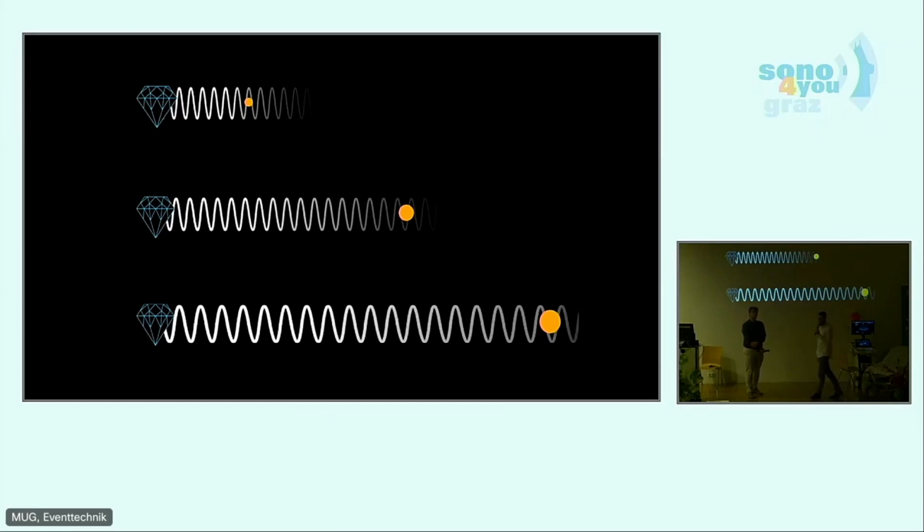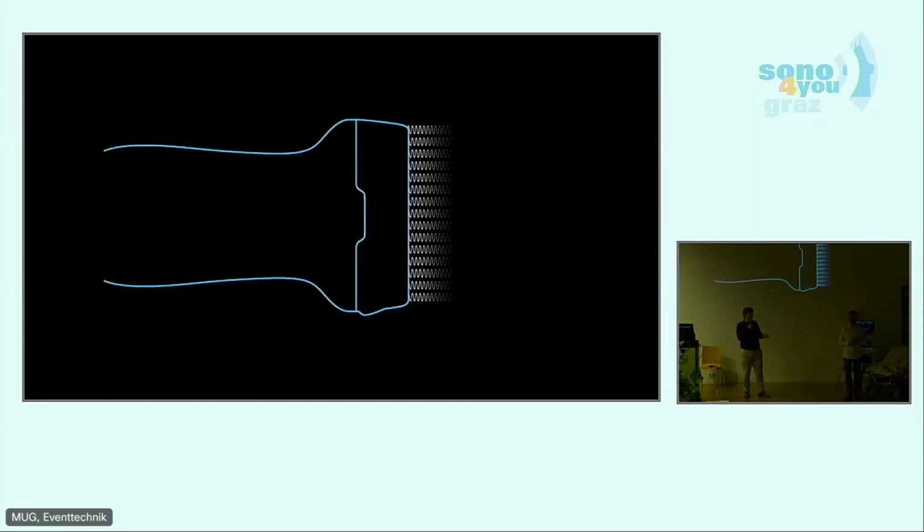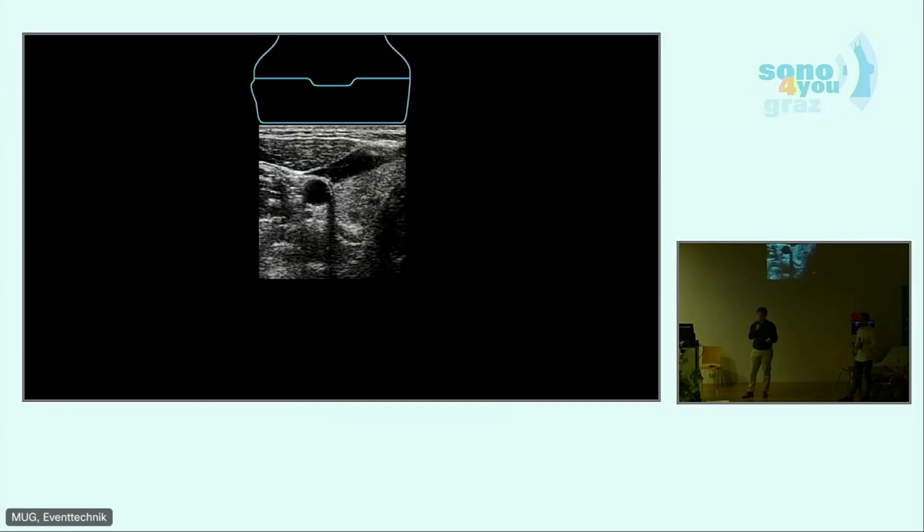So, as I mentioned now, we have different probes. Matthias, could you give us a little introduction into the different kinds of ultrasound probes? Of course, Romeo. We have 3 different probes we will be using frequently. Our first probe is our linear one. As you can see, we have a lot of crystals close to each other, sending out a very high frequency. So we penetrate not that deep, only a few centimeters, but we will get back a very high resolution. And we can use that for scanning vessels, for example, on the neck, as you can see in this picture.